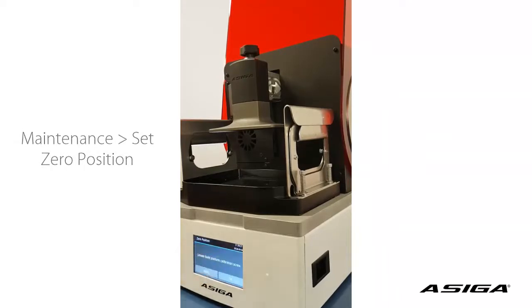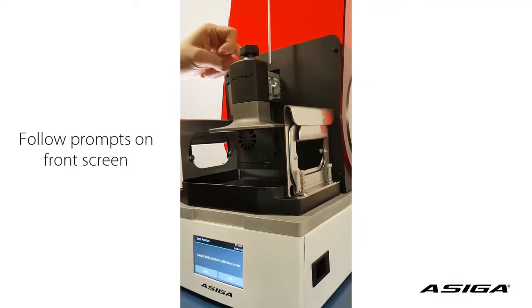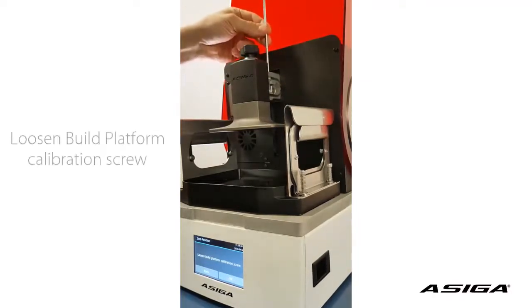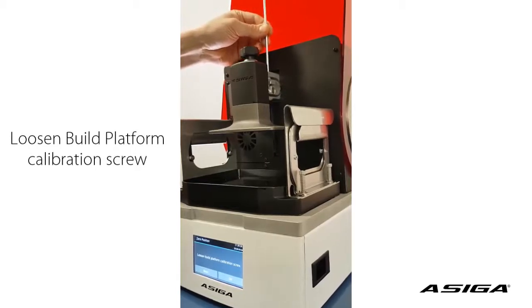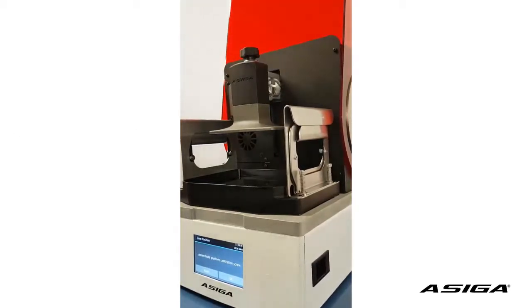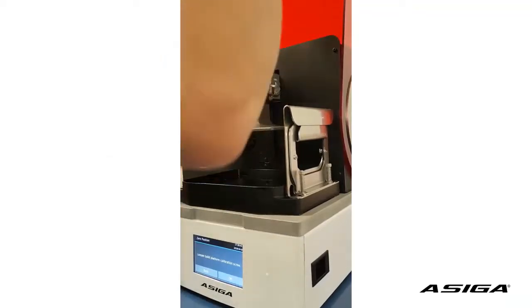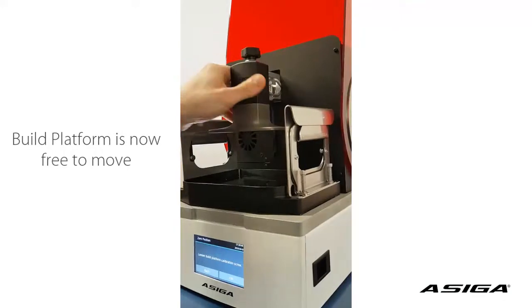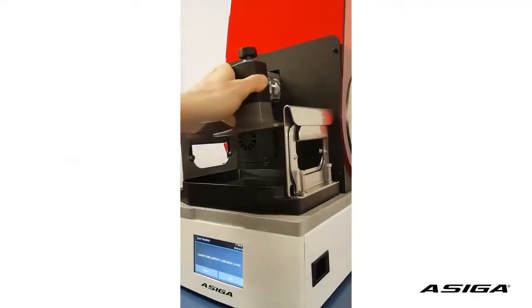Loosen the build platform calibration screw. The build platform calibration screw is the screw on the build platform holder. You loosen it by turning it anti-clockwise. Now you can see the platform is loose.